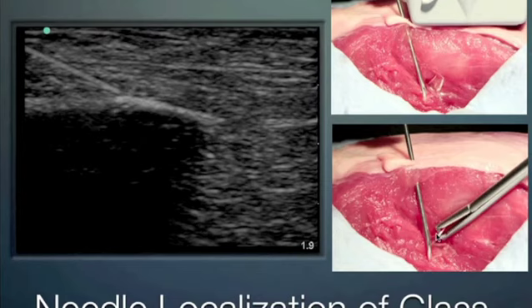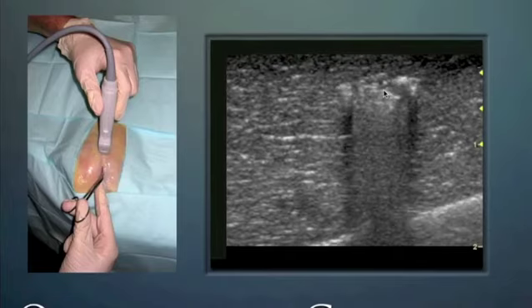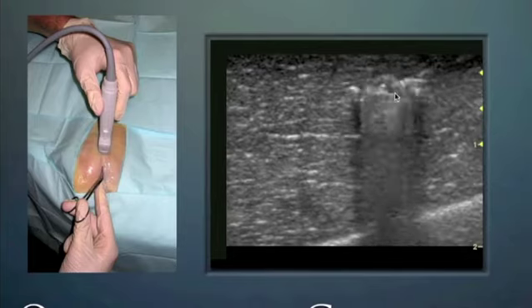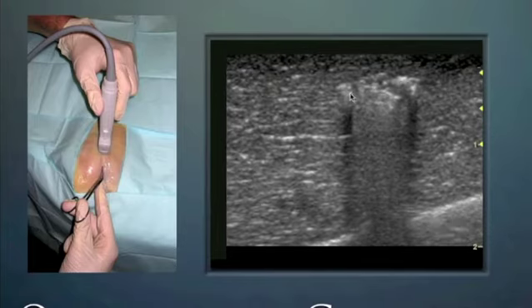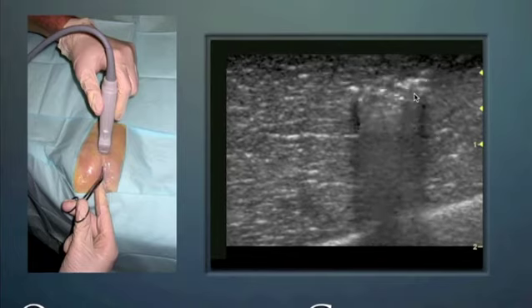And when you're opening and closing a grasping device, this is how it can look underneath the skin on ultrasound. We see these white dots that we see everywhere. That's the air that's in the track that the grasper basically created. As the grasper goes through the soft tissue, it creates a little air track, and that's what all these little white dots are here.